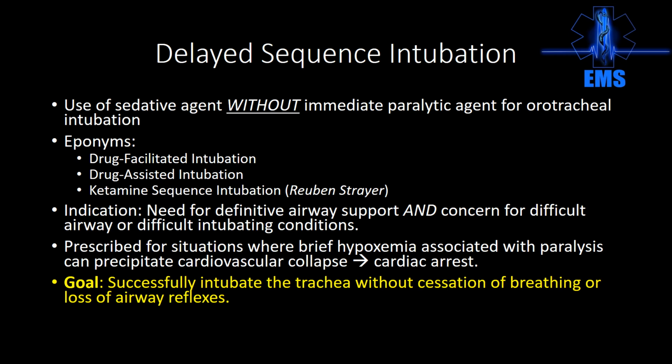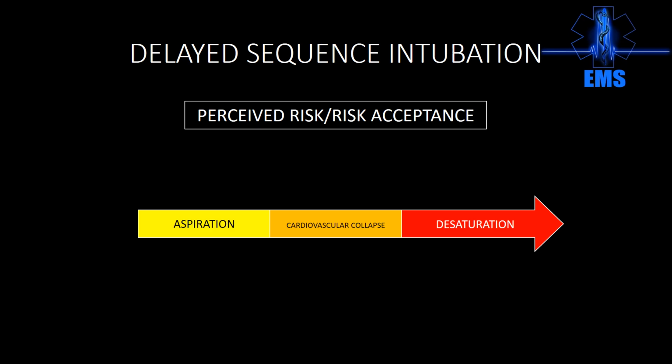So the patient needs resuscitation, but maybe they will not cooperate with that. They have a behavioral emergency, or they're hypoxic and now they're combative and agitated, and we need to be able to ventilate the patient, but they're pushing the bag off or pushing the CPAP off. You give them a dose of ketamine, which is an induction agent dose, and you bag the patient while you're prepping them to be intubated, but you're resuscitating them at the same time, whether that be with blood products or fluid or pressors. The idea is that you're getting their hemodynamic status more in line with an acceptable plane for intubation.